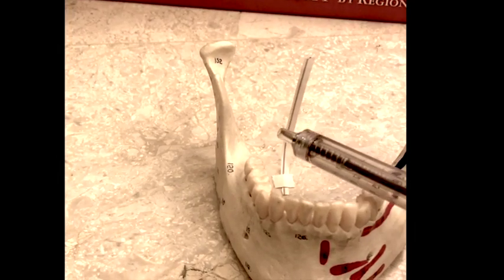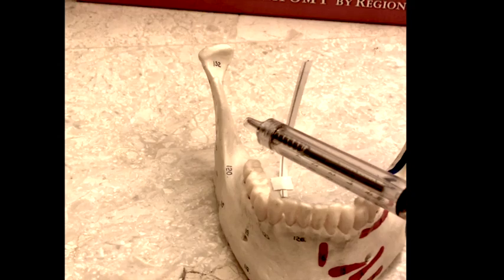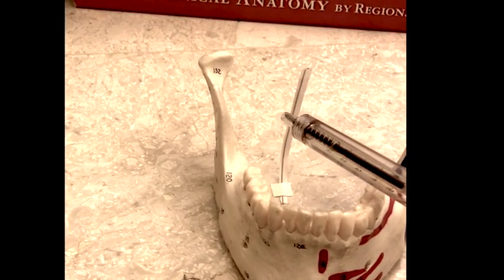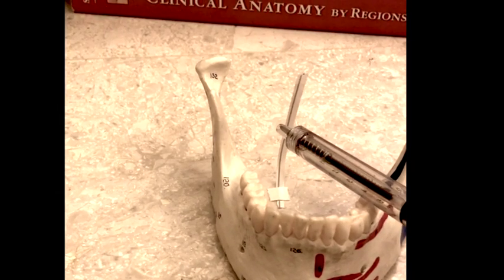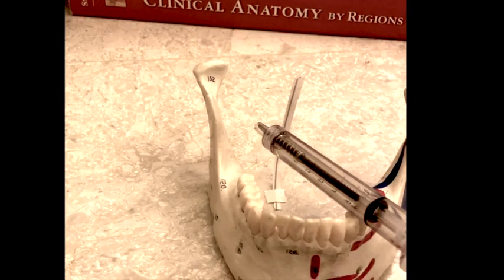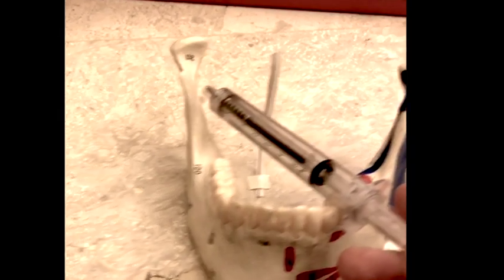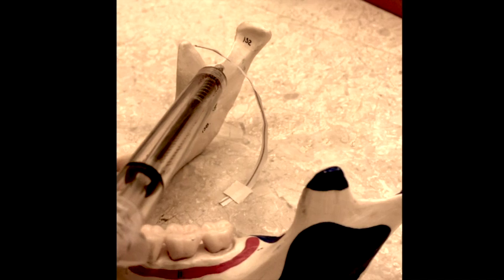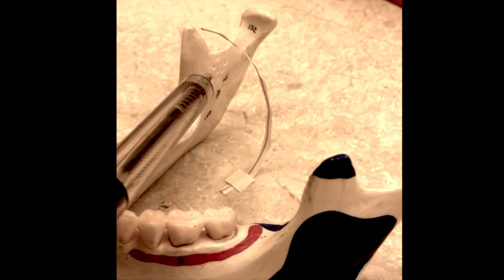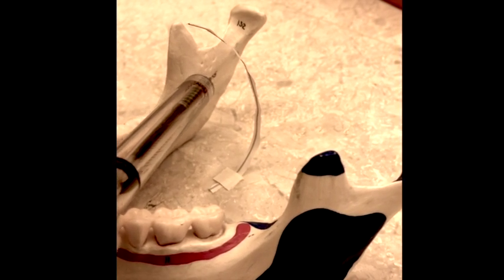We already determined the height, which goes from the coronoid notch to the deepest part of the pterygomandibular raphe. I need to be at two-thirds of this space, so I'll be exactly here. My needle is now in exactly the right location — I'm around the mandibular foramen.